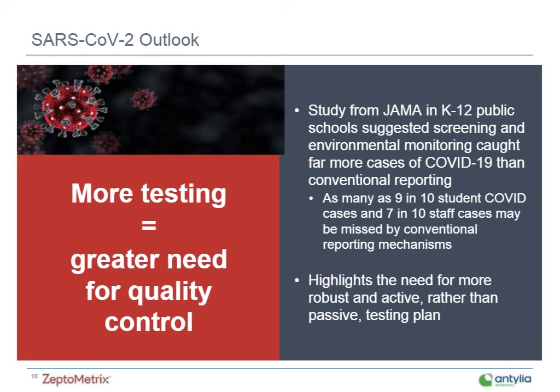But what I think is a major takeaway here is that more testing equals a greater need for good quality control systems and a need for the availability of reliable quality controls to be used across all test systems and platforms. Of course, different kinds of tests have different kinds of controls. So for the purposes of today, we'll be focusing specifically on PCR-based molecular diagnostic tests.